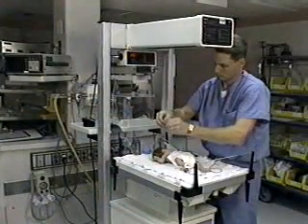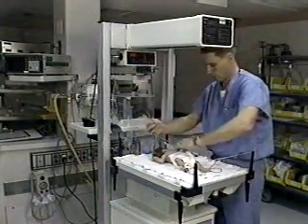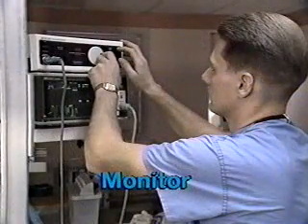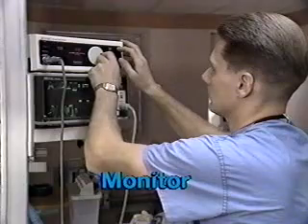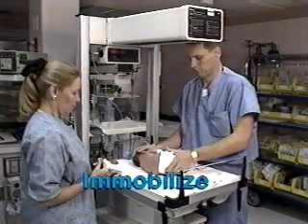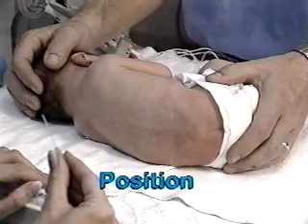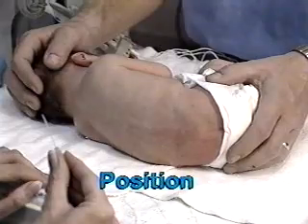Working very closely with the practitioner, the assistant must focus on 3 tasks: monitoring the infant so as not to compromise the patient during the procedure, immobilizing the infant to minimize trauma from any movement, and positioning the infant to provide maximal exposure of the intervertebral space.